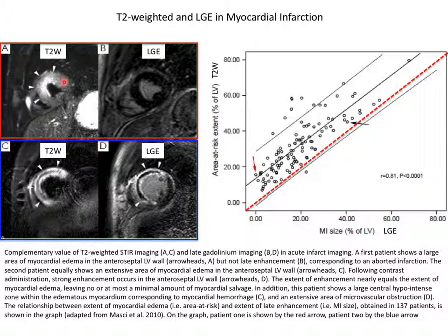When you do, at that time, late gadolinium enhancement on that patient, you would think, oh, I have all this high T2 value. That does not look normal. I probably have an infarct there. Turns out you do not, right? That tissue has not yet infarcted, right? And so the interesting value here is this person has acute damage, but the tissue itself is likely highly salvageable.